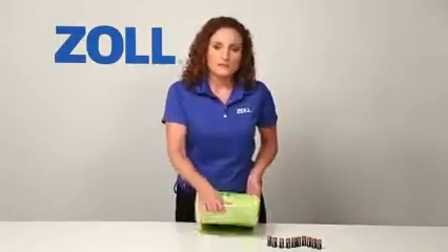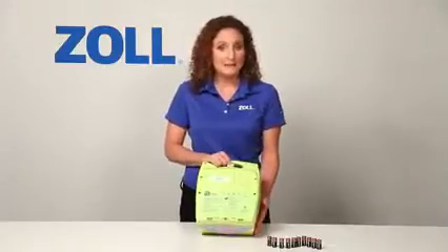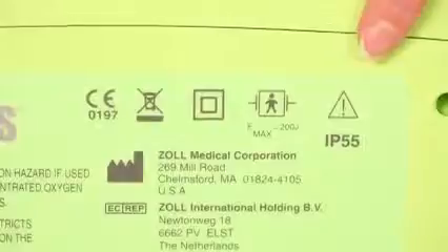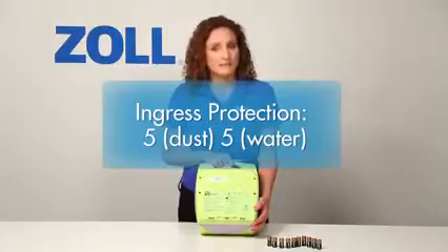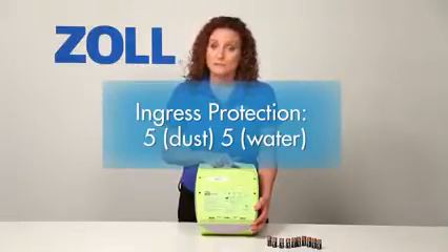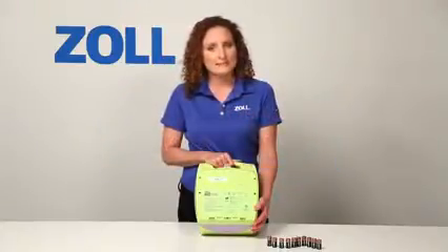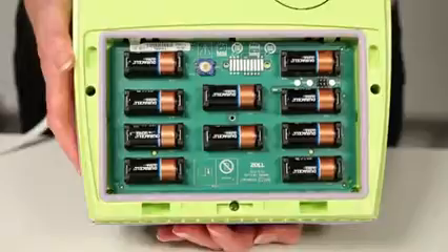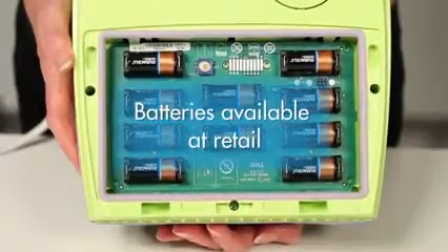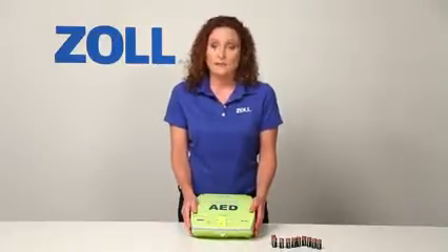Let me review a few other features of the AED Plus. Notice that the door to the battery compartment has IP55 printed on it. The ingress protection rating is 5 for particles — meaning it's protected from dust — and 5 for water, meaning it can withstand spraying jets of water. Very few AEDs on the market today are this well protected. The AED Plus is powered by 10 123A lithium batteries, which you can purchase at retail, for example from any camera store, at relatively low cost compared to proprietary battery packs other manufacturers sell.